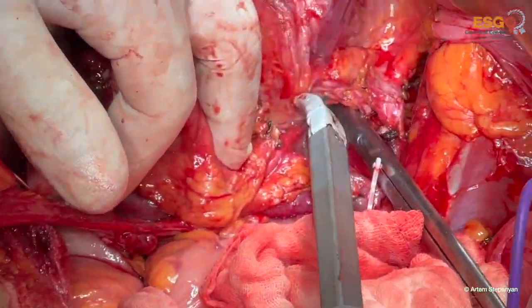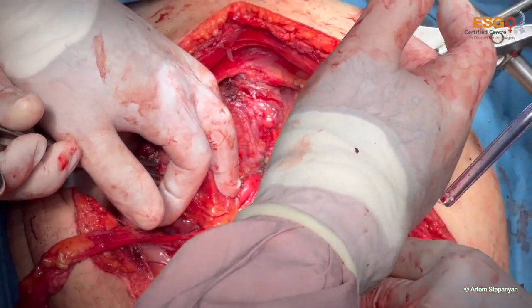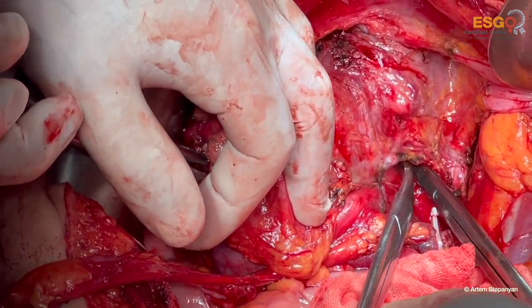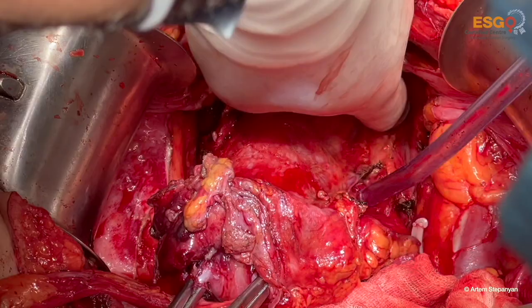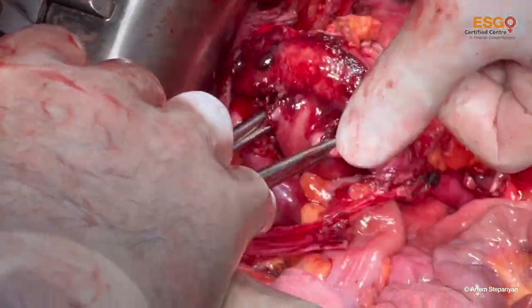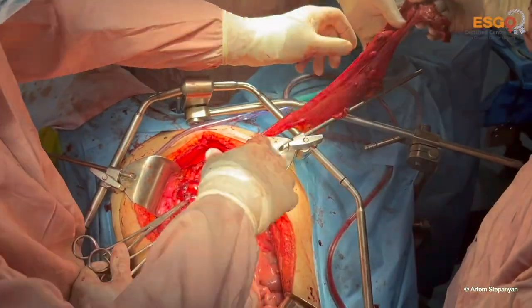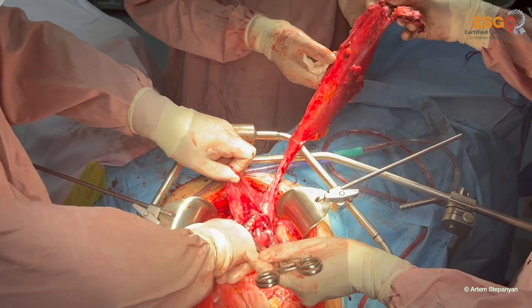And so finally, we will have both ureters under our total visual control and we'll be able to safely perform retrograde hysterectomy. As for the colon, it's not clear at the moment what we're gonna do. It's possible to shave away the tumor, it's possible to perform discoid resection, it's possible to perform colorectal resection. And the advice is to mobilize everything and to keep it attached to the colon and just after that decide what you want to do with the colon.